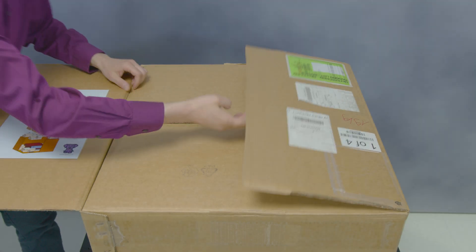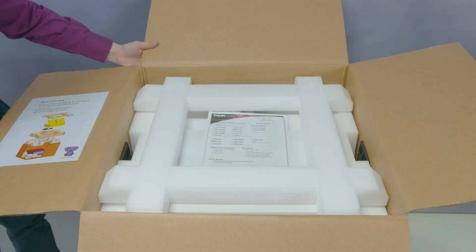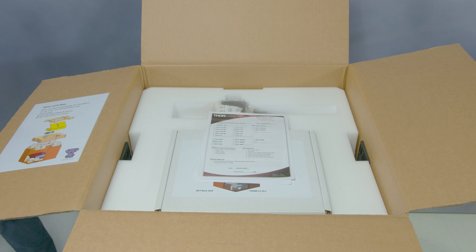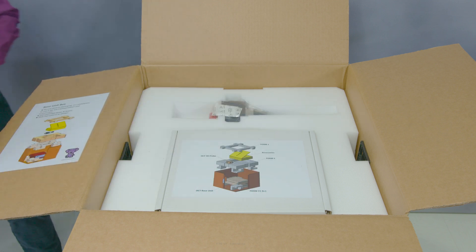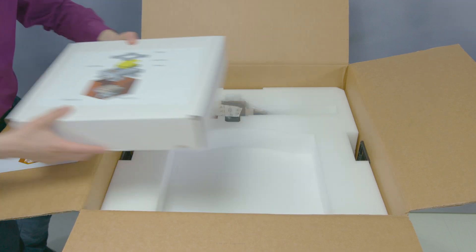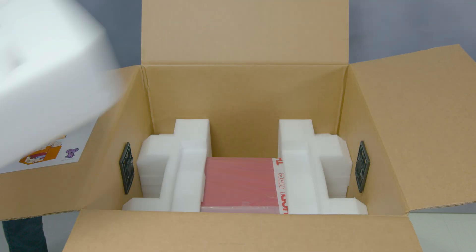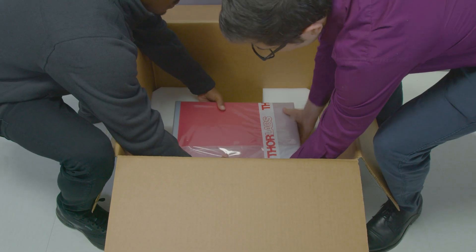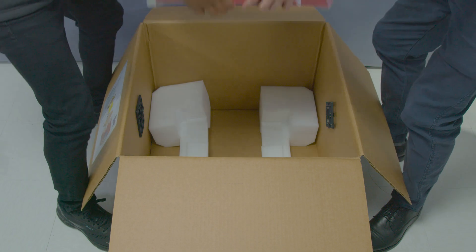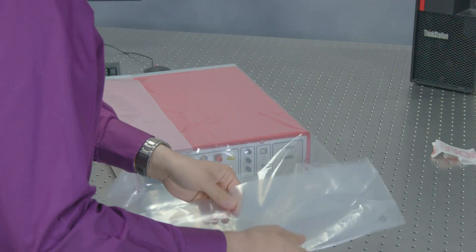Open the box labeled OCT system. A packing list and quick start guide are included on the OCT base unit. Use two people to lift the OCT unit out of the box. Carefully unpack the additional components.